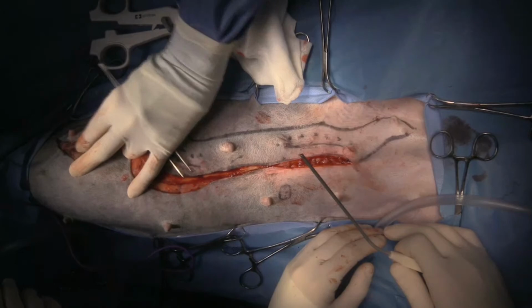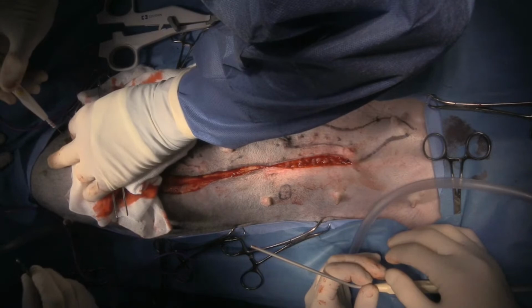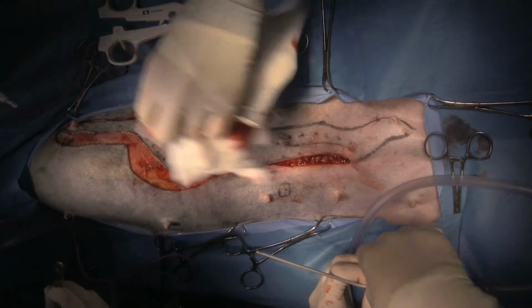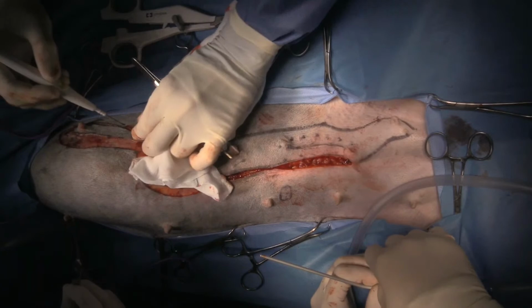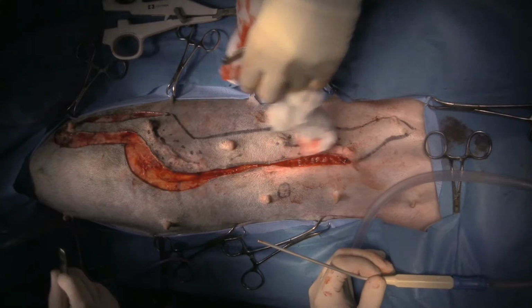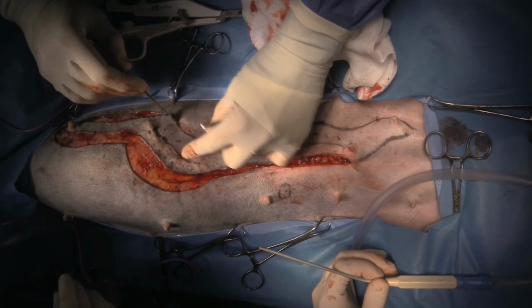This owner mentioned that this dog's skin has always been very thin, and I was skeptical, but it actually is very thin skin. And the reaction that we're getting from the cautery is not that the dog can feel it, it's just directly stimulating the musculature. We can't forget to take out that other tumor.